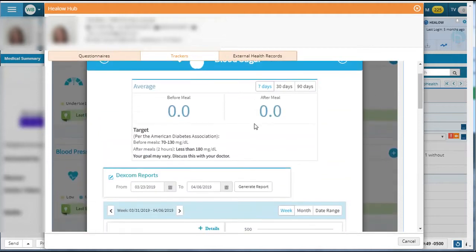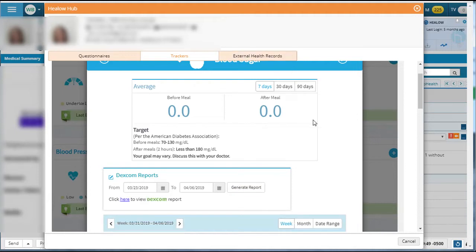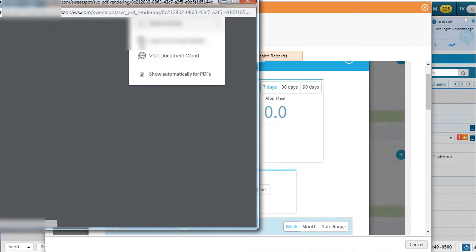You'll see the glucose, the Dexcom reports. You can choose the dates, then click the generate report button. Just like the EXE version, you'll get a blue hyperlink that launches a PDF for you.